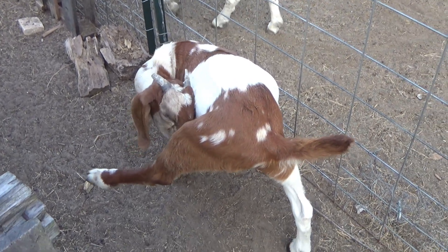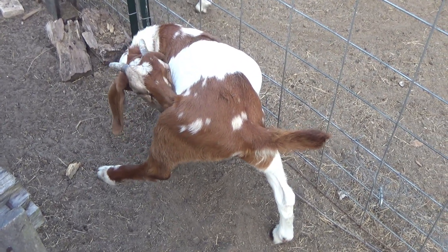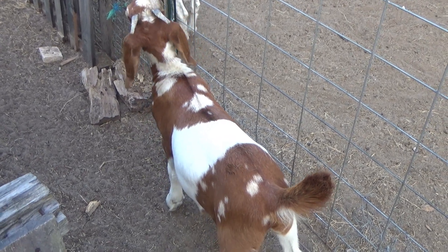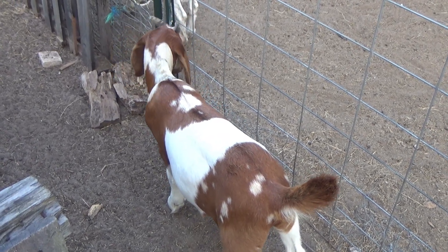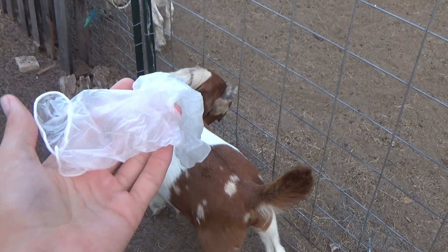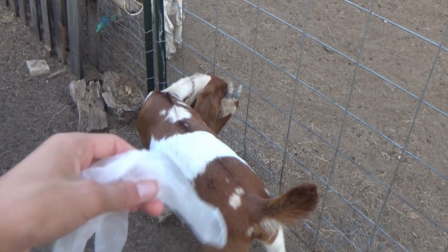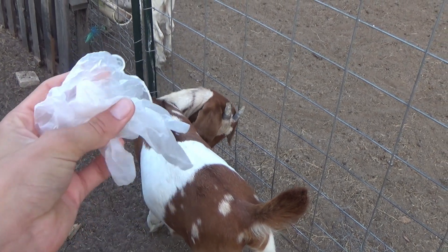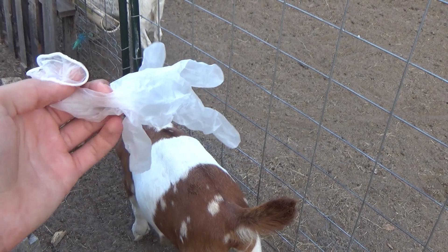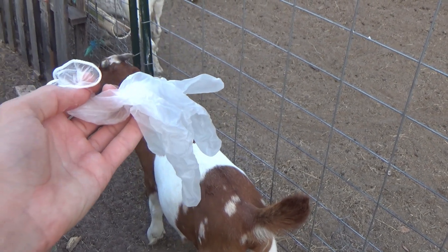So this right here is Aeneas. He is the one we're going to be doing the fecal test on today. All you're going to need for gathering the fecal matter — the poo — is a little latex glove. I just like to use these because they keep all the pellets separated really nicely and clean, and I can just pop this glove in the fridge to keep them cool until I'm able to do the fecal test. Now begins the waiting game.